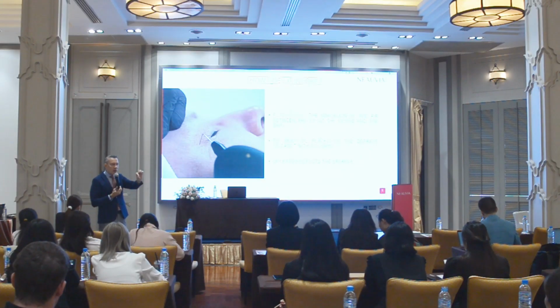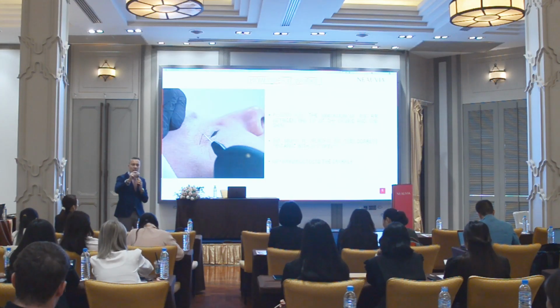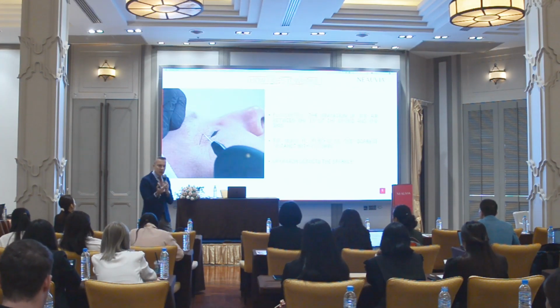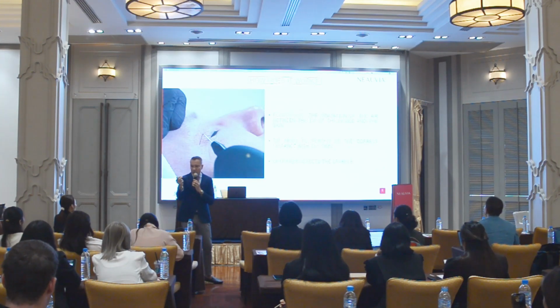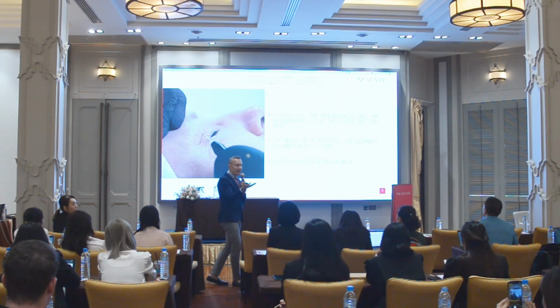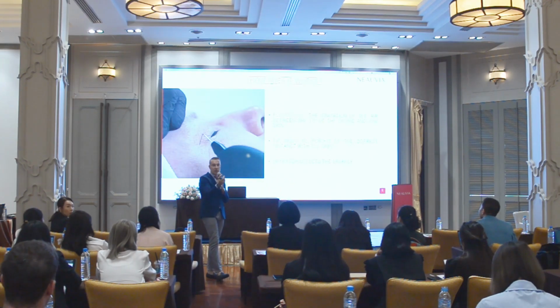very short. So we will create this difference of potential. So whenever we press the button on the plasma IQ, we will see this sparkle. This sparkle is going to cause the sublimation of the skin. Sublimation. What is sublimation? From solid to gas. So our skin will pass from solid state to gas. So it's improper to say vaporization, because vaporization is when the liquid is going to gas. In this case, it's called sublimation.